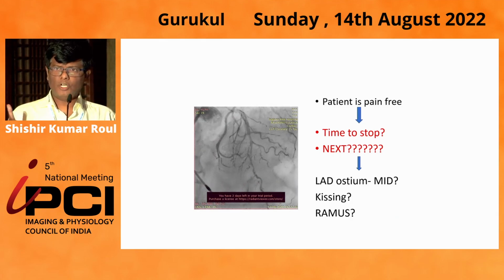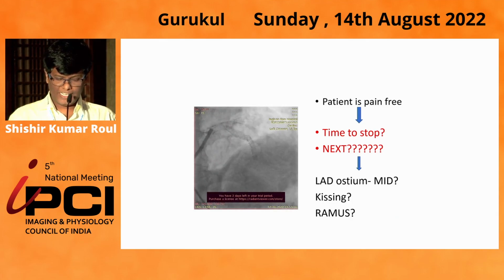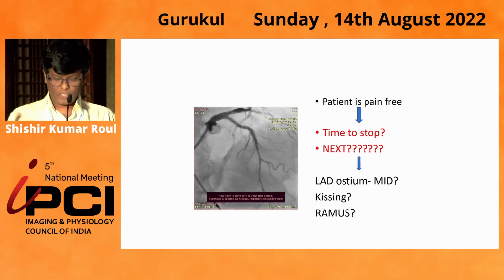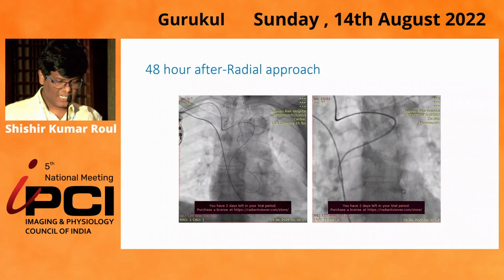So is it the time to stop? My patient has stopped having chest pain. So what did I do to the LAD ostium? No kissing. What did I do to the mid LAD? So what about the Ramus? So I took some breath. After 48 hours, I just retried.